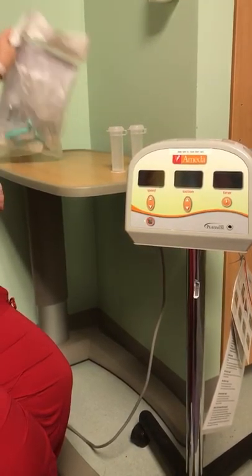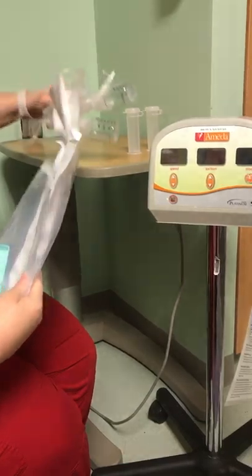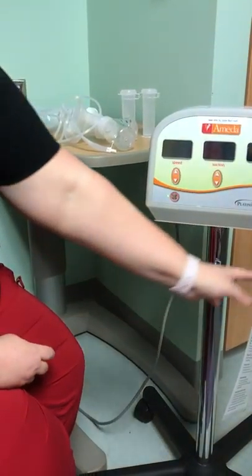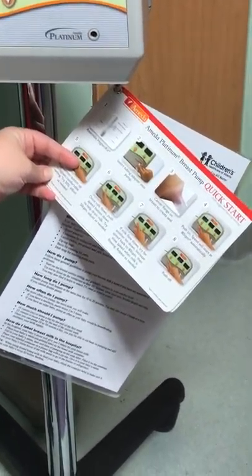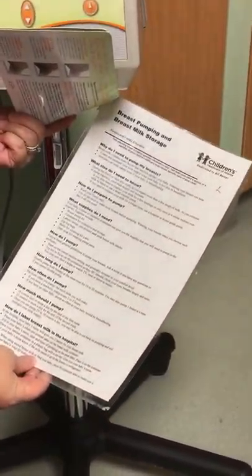For a mom that has never used a pump — some moms have never used a hospital-grade pump and some have never used a pump at all — they may need some instruction on how to use this. You can always refer to the quick start card that is usually attached to the breast pump. There's also a copy of the Choa breast pumping and breast milk storage education tip sheet.